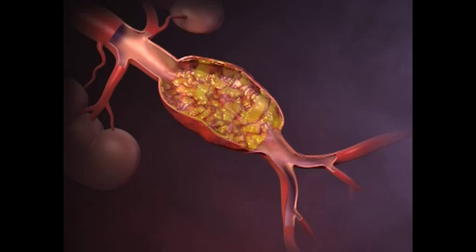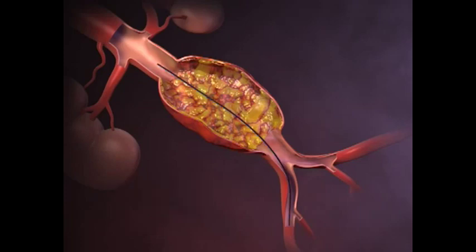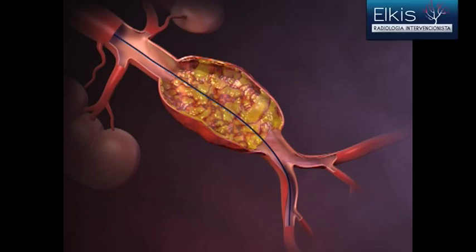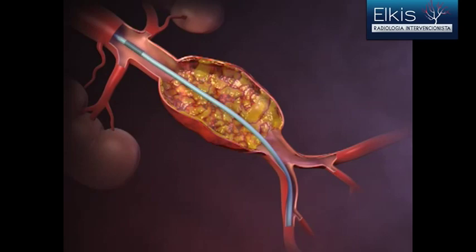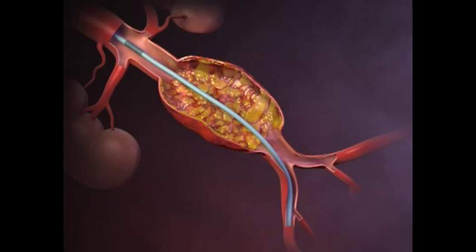In this procedure, a guide wire is introduced into the abdominal aorta through a femoral artery. This is followed by the sheathed main body of the stent graft, which is positioned with the use of fluoroscopy.